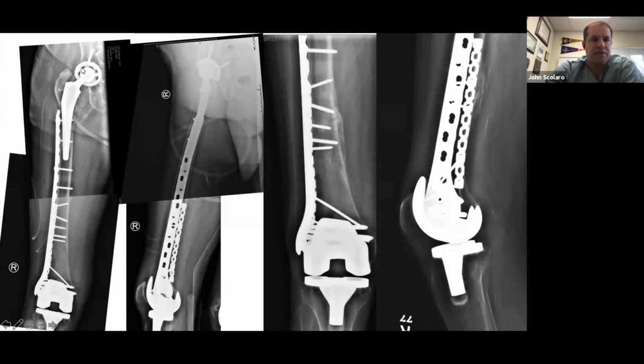And I think there is something to having a nice reduction, so that you're not relying on the implant to do all the work. Once you have apposition of the fracture surfaces, that can help a lot. One of the things that oftentimes comes up is people are knee jerk going to cerclage cables the minute they have to get around other implants. And I think there have been biomechanical studies that have shown the importance of utilizing screws instead of cables when possible.